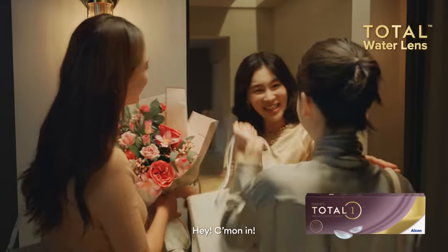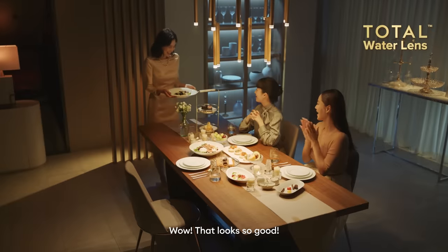Total Water Lens. Hey, come on in. Ta-da! Wow, that looks so good. Let's take a picture.